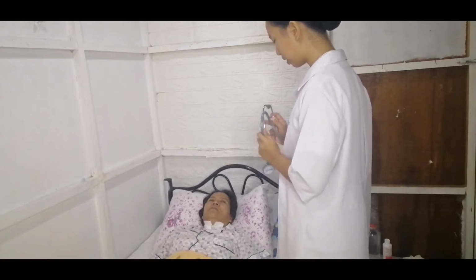Move the overbed table close to your work area and raise to waist height. Then next, check for lung sounds. Check ko lang po yung lung sounds niya.